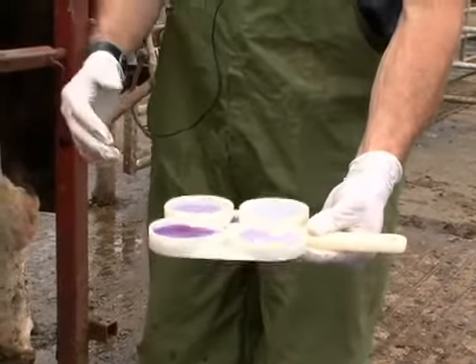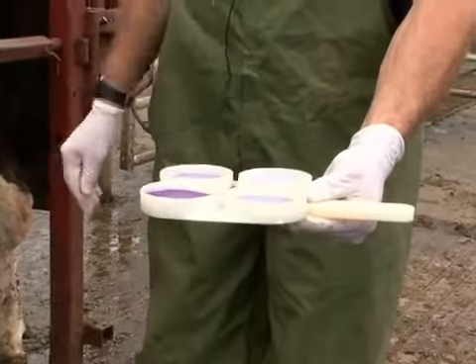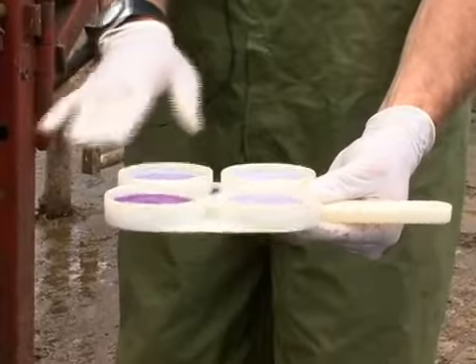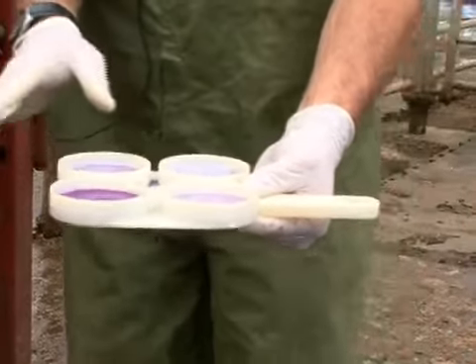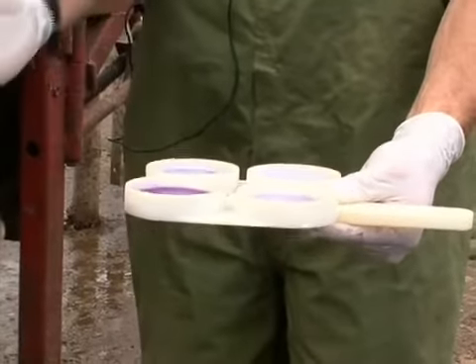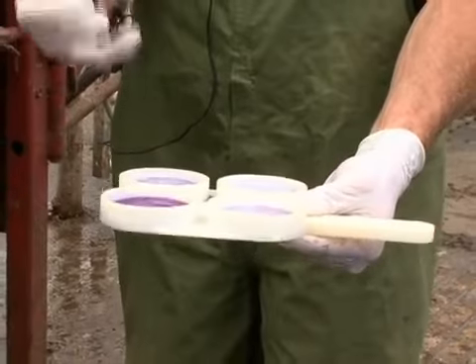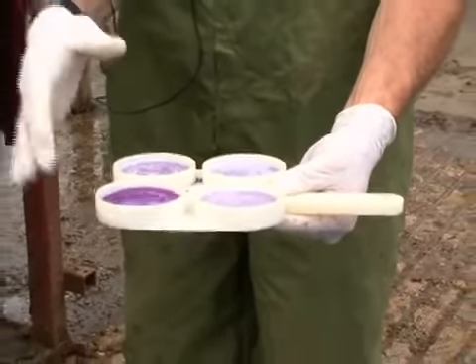Again, like I said earlier, the test is scored according to how thick the solution becomes. If we see a mixture that continues to be very watery and liquidy, that typical test would be a trace or negative. And then the scoring system will go 1, 2, and 3 beyond that. The higher you go with the number to 3, the more cells are actually in that gland, creating a thicker solution. Millions and millions of cells.